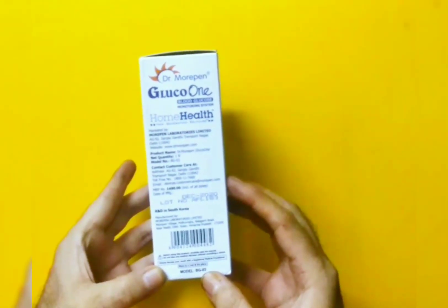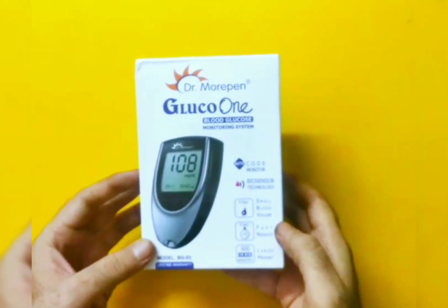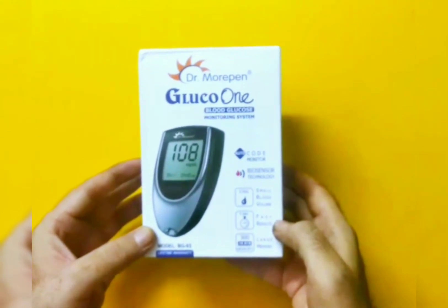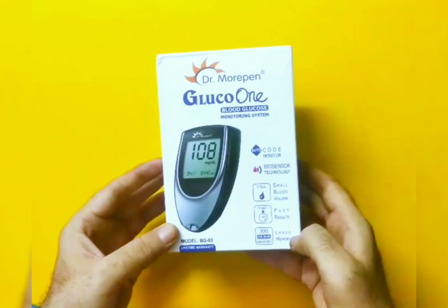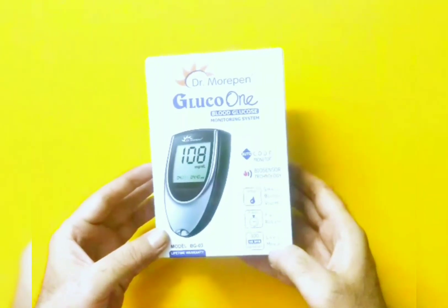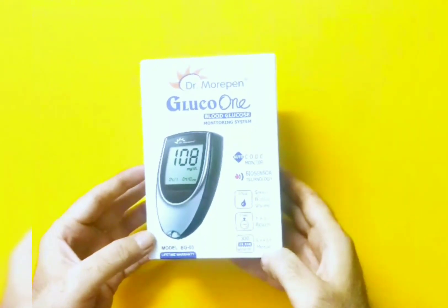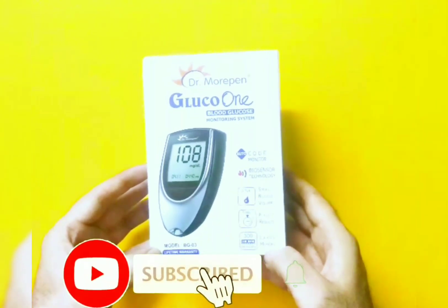You can get it easily for around 600 to 700 rupees. It's very easy to use. Some of the features: it requires very small blood volume — 0.5 micro ml to test — and it gives results very fast, in five seconds. It has memory also, so you can refer back to your results. It can store around 300 data points, so 300 test results can be stored.